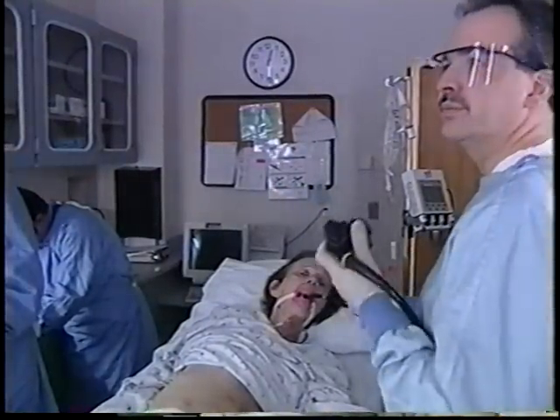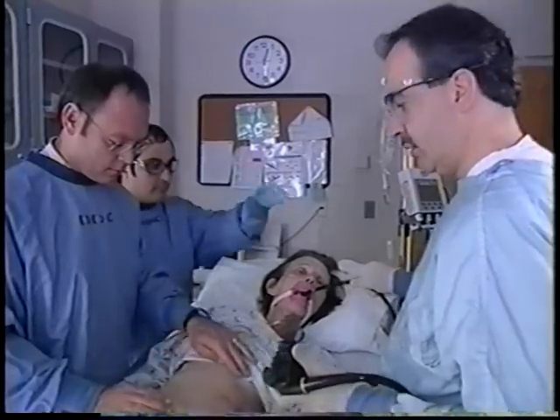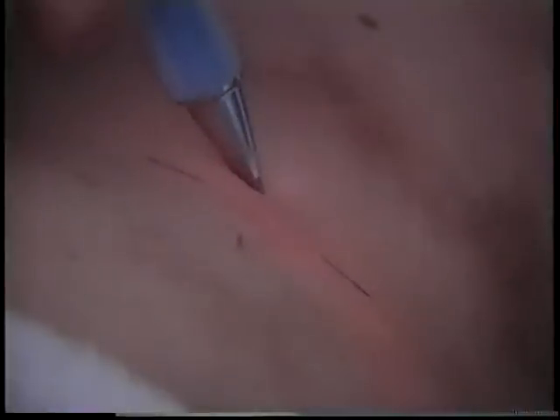The light from the endoscope is directed at the abdominal wall. With the lights in the room dimmed, a transillumination effect is seen, generally in the left upper quadrant of the patient's abdomen. At the point where the transillumination is most clear, finger pressure is applied. The indentation of the gastric wall produced by palpation is noted endoscopically, and the site is marked. The site is then prepped using standard technique.